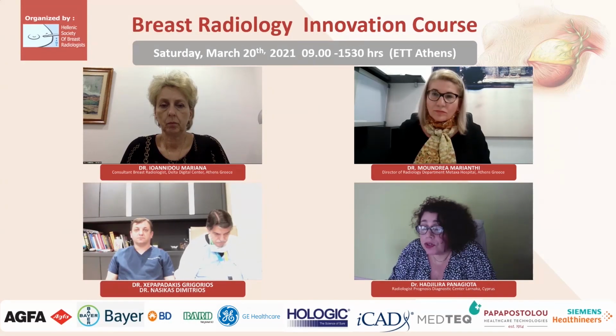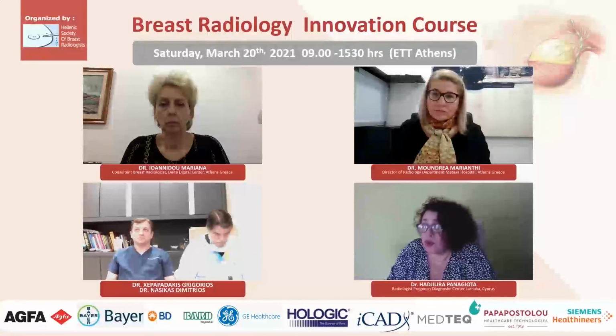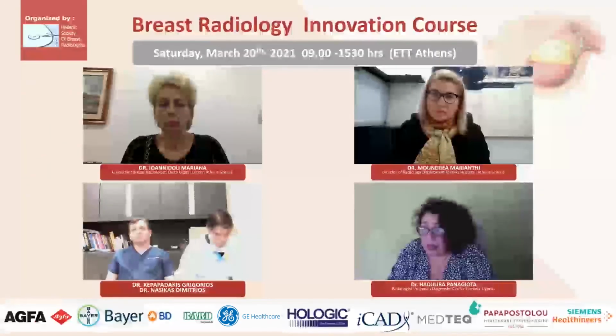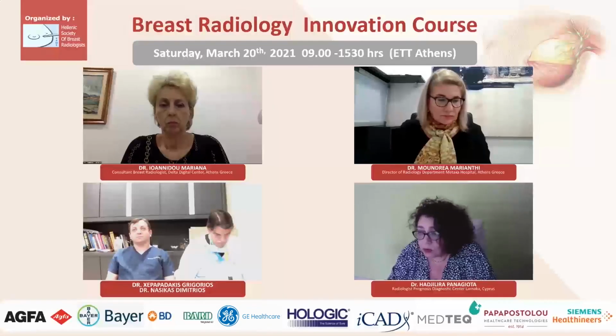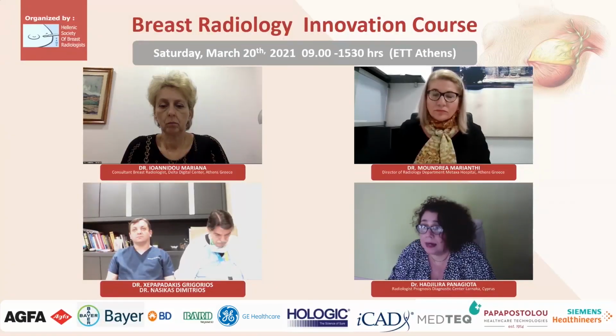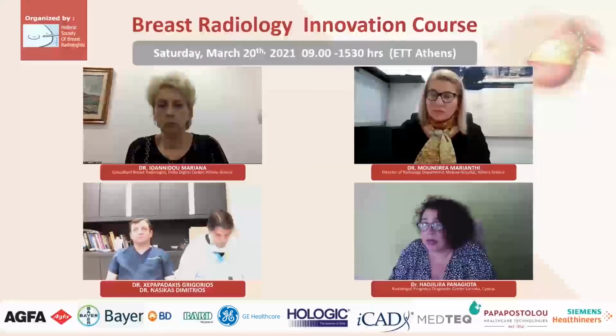Artificial intelligence also is proposed for diagnosis decision support. As a radiologist, though the performance of artificial intelligence is very impressive, I cannot advocate for the use of artificial intelligence alone. There are issues like the inability of AI to compare prior and contralateral examinations. As human radiologists, we rely heavily on this comparison to decide whether we need to do something about a lesion.